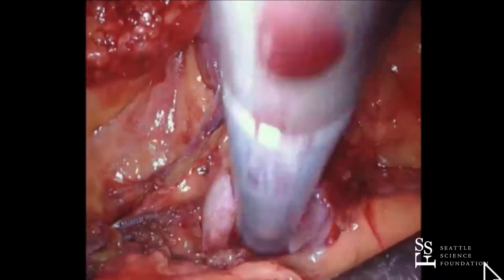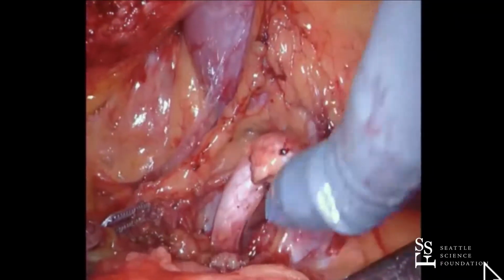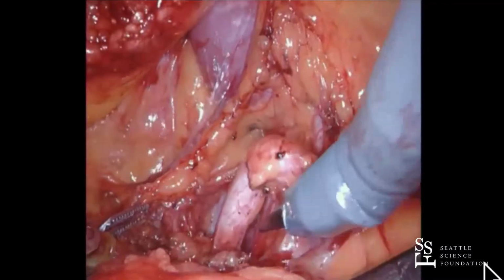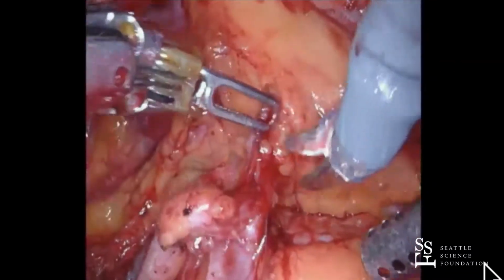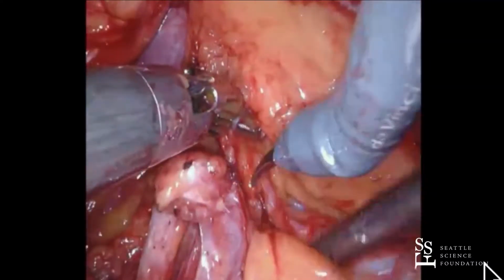So that's the main artery right there. That's before the bifurcation. And of course, this is cava here, so we're behind it. So we got a great view of it. That's beautiful. That's beautiful. Yeah.